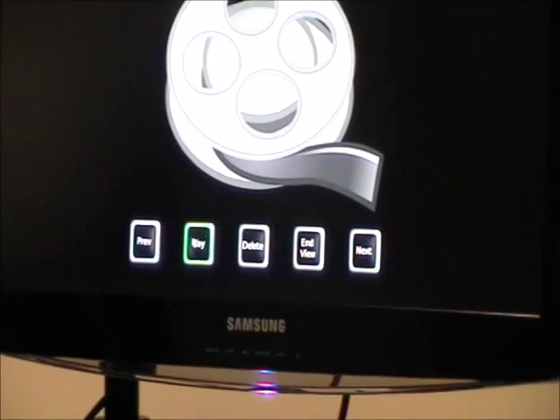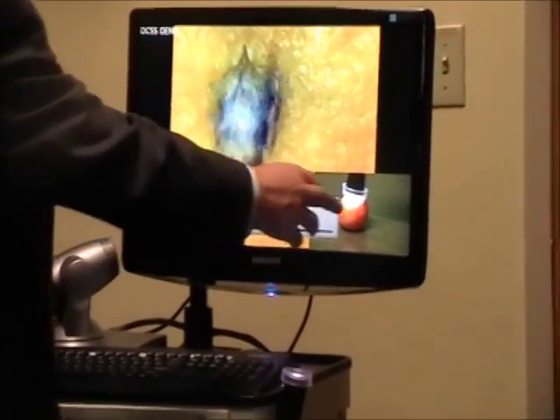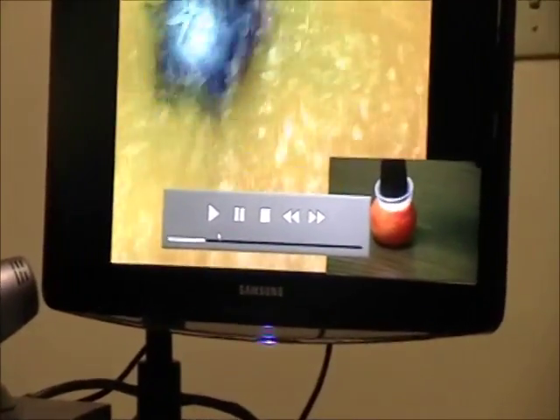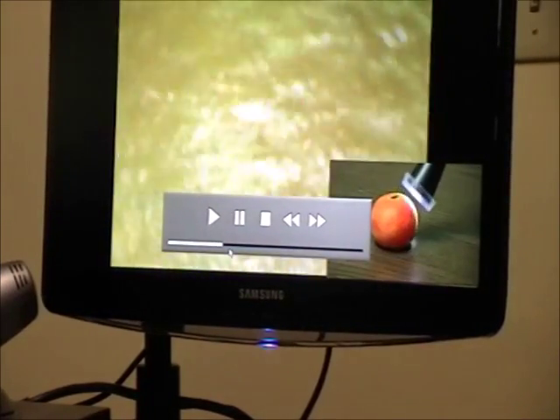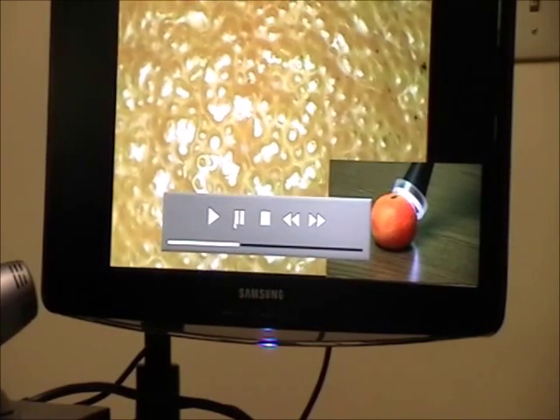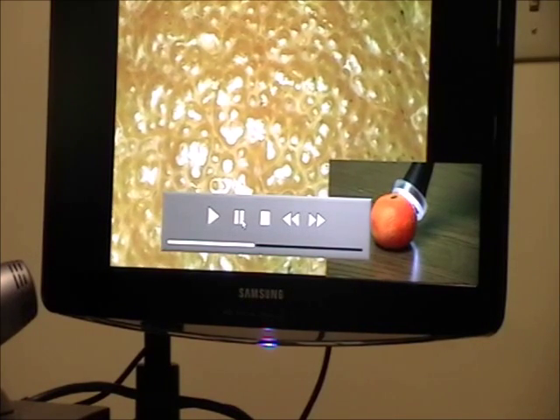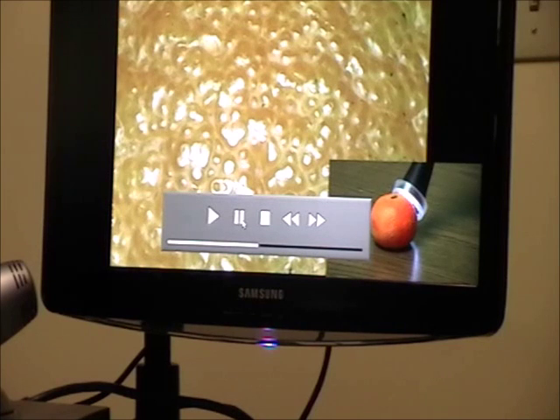This next one was the video segment we captured. So we're now seeing motion video, and we could see the movement of the handheld camera in relation to, again, the patient's body as it's moved around, and we see the areas of interest. So these are, again, viewed in synchronized fashion, so they provide two simultaneous views even through motion video. You can pause at any point if you see a spot that you think is very, very interesting. You can just hit pause and freeze and take a closer look at the area of interest, or you could just continue right on through.